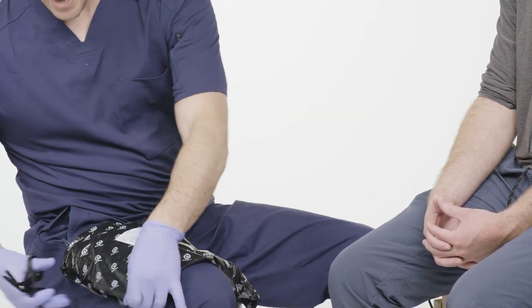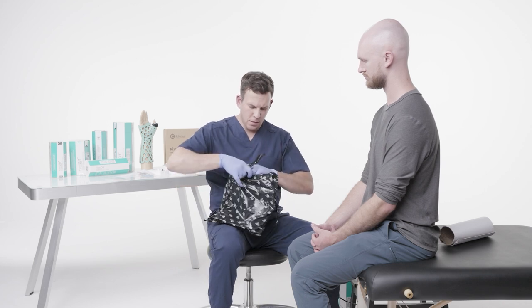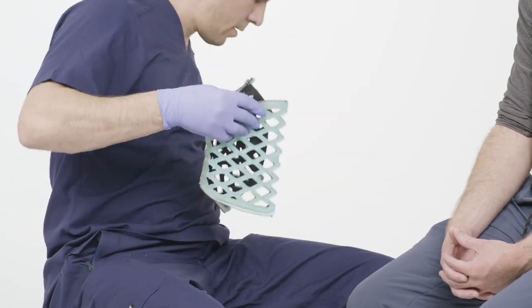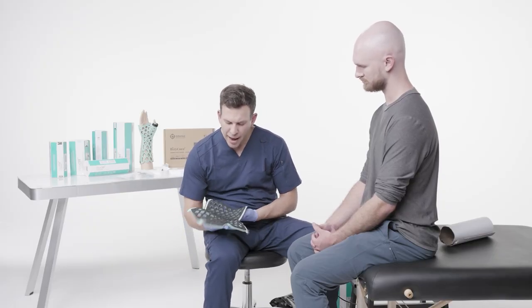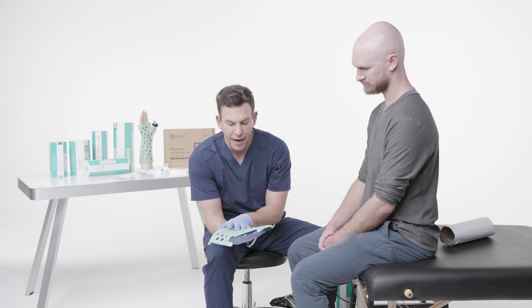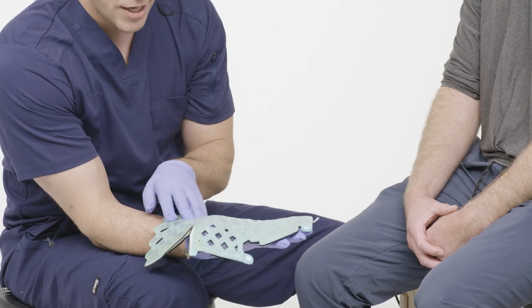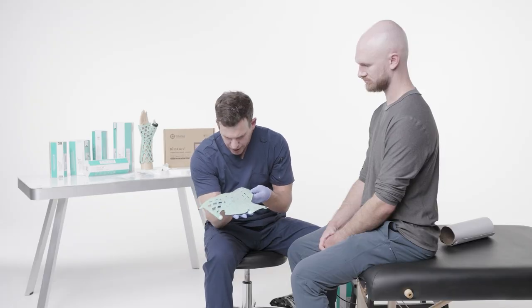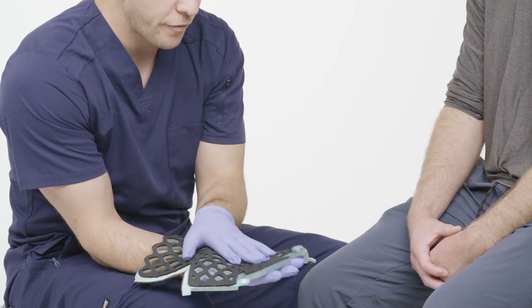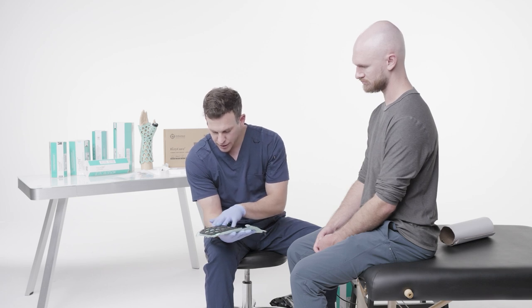I'm going to take my scissors and open up the bag. The first thing I want to do is inspect the brace. I want to look at the outer side — the silicone and resin layer where the gel is — and make sure there are no leaks and no cracks in the brace at all. If there are, you can repackage it and send it back to the manufacturer. Make sure the zipper is well intact. Then flip it over to the foam side — this is what's going to touch the skin and immobilize the thumb and the wrist.